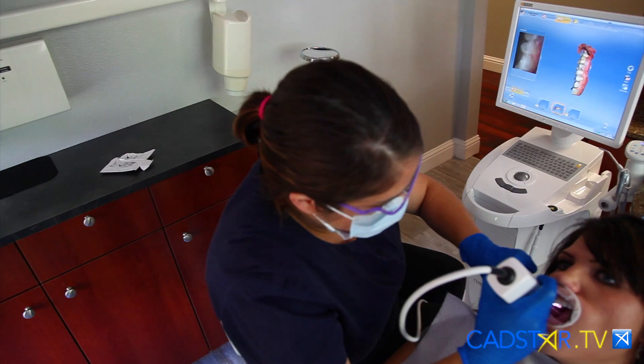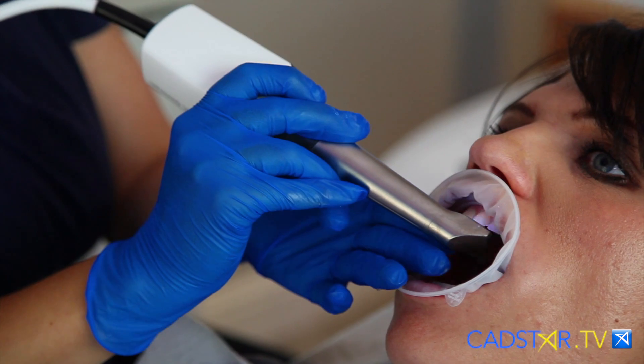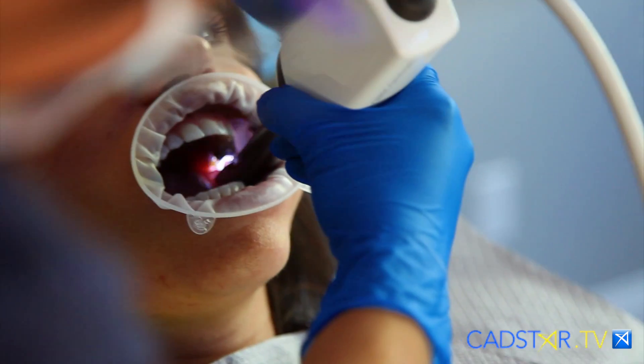Now here's the thing in a design screen. Hopefully with good records — and we know not every day goes like this — but with really good records, preparing well, taking good impressions, hopefully we don't have to use a lot of tools. There are a lot of tools that you can draw on to perfect your restoration.